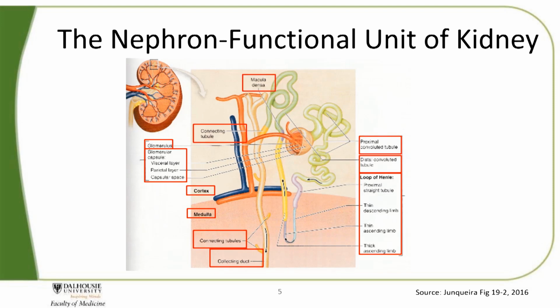Okay, now that we know some basics, let's listen to our nephrologist, Dr. Acott, explain how the core needle biopsy set works. But I can show you.